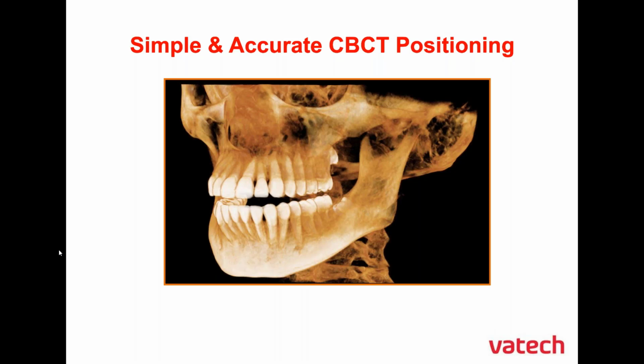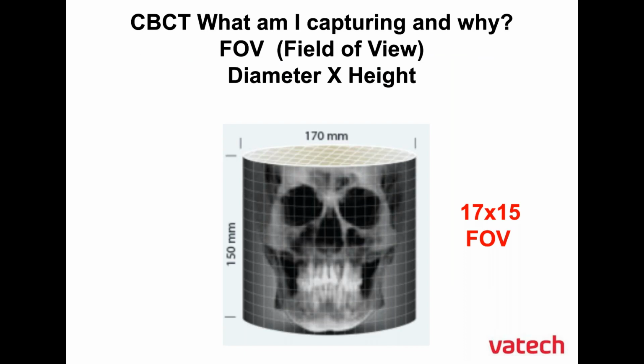So today's topic, we're going to talk about simple and accurate CBCT positioning, really making everyone's lives easier and patient interaction a lot easier and a good experience for both the clinician and the patient. So Paul, first let's define what we're going to be capturing as far as field of view, visualizing that to give an understanding to everybody of what exactly is happening when we take our CT.